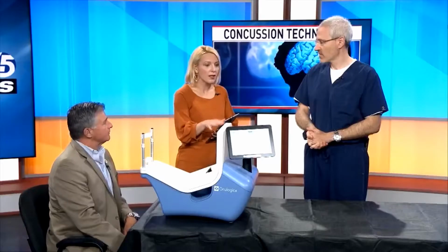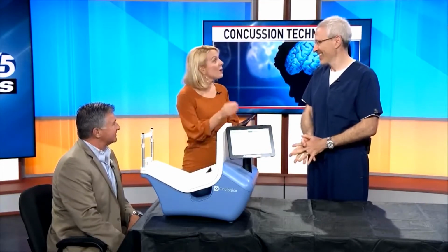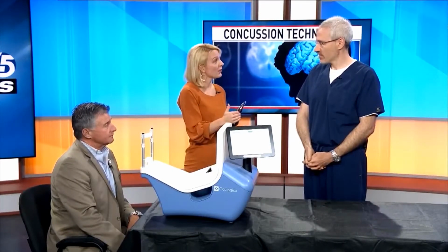That's incredible. Now, let's say a kid would come in, someone who hasn't done motocross for so many years. They come in, they have a positive. How long would it normally take if this is the first or second time that they've had a concussion for it to read back to normal? And does it ever read normal? That's a great question. It might read normal. Presumably, if it's their first time, it would go back to normal. Our protocol is to have them come back in every couple days and retest them. And once it goes back to normal and they're free of symptoms, we would clear them to go back to playing sports.